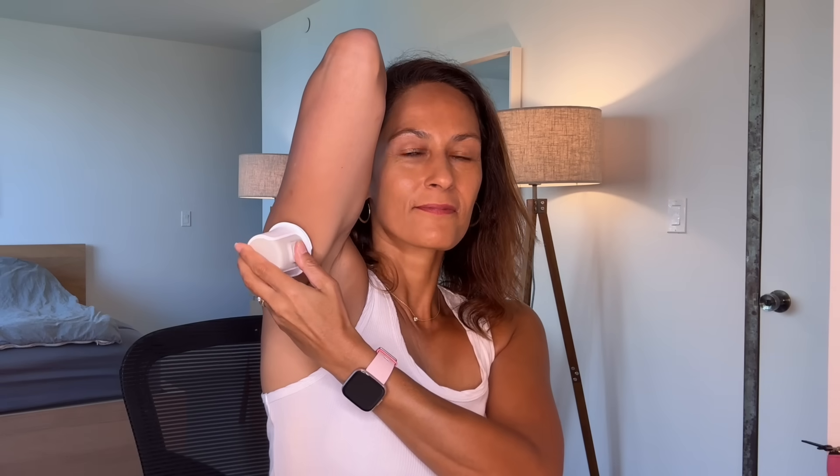Have you also noticed that your Dexcom G7 has been having some issues? Let's unpack it and talk about what we can do about it. I'm Christelle and I've been living with type 1 diabetes since 1997, and I've been using the Dexcom G7 for well over two years now. I really like my Dexcom G7, but it does have some issues. But the good news is that a lot of these issues also have solutions.